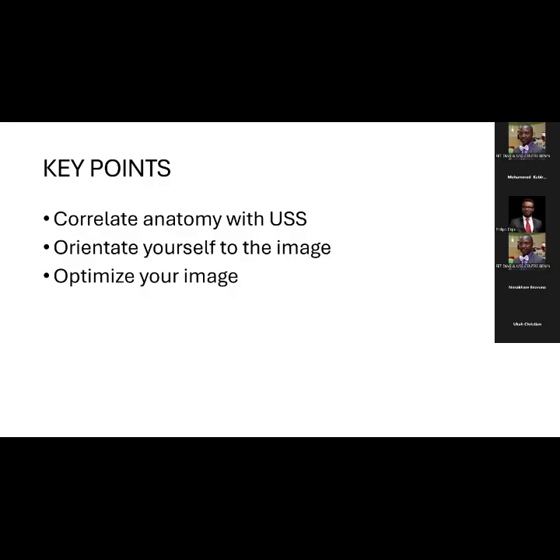So you probably see both ovaries at the same time, depending on the size of the ovary, the uterus, and everything. But when you are looking for the ovary, you do not necessarily go sagittal, coronal, you are searching for it. So if you place your probe sagittally, that's how you should begin.